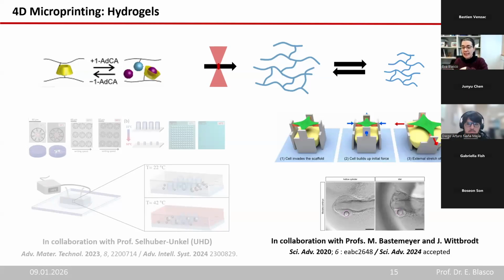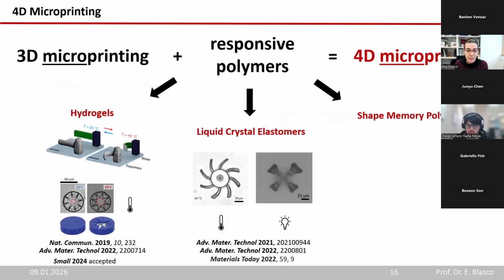With another collaboration with biologists, we went a bit further, and we did not just print and put the cells inside, but in this case, we injected biocompatible ink inside an in vivo fish embryo. Here it may be a bit small for you, but we injected it in the eye, and we could print inside. Here you have a small star. This is, of course, at the beginning very much proof of concept, but the idea behind it is that in transparent systems such as this small fish, you can think of even in vivo or in-organism implants.